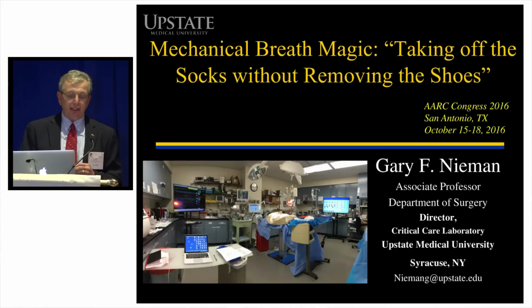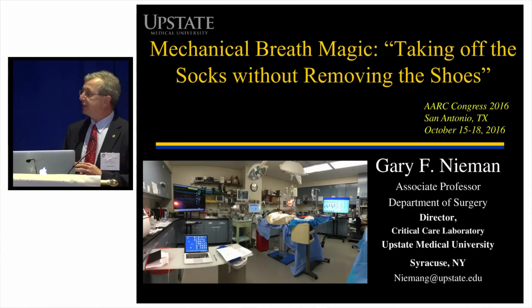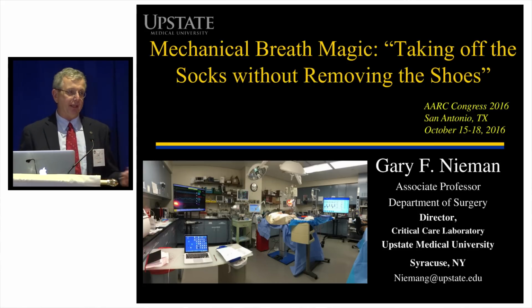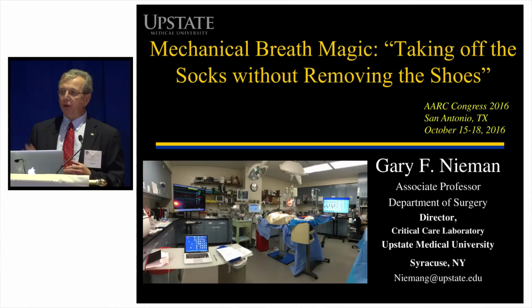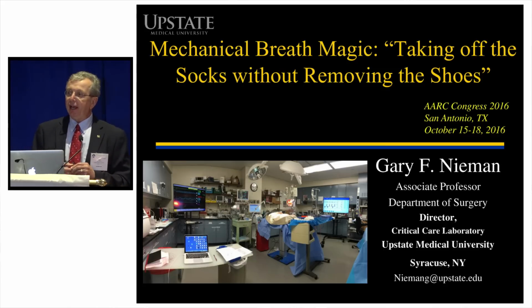The title of my talk today, as you see, is Mechanical Breath Magic, Taking Off the Socks Without Removing the Shoes. And what do I mean by this? Well, basically, look at the problem we have with ARDS. We have this heterogeneously ventilated lung. We have edema. We have loss of surfactant. We have normal lung. We have to push one breath into that patient's lung to try to oxygenate and ventilate that patient and not injure the lung further with a ventilator. That's a pretty tough trick. It's almost like a magic trick. It'd be almost like trying to take someone's shoes off or socks off without removing the shoes.